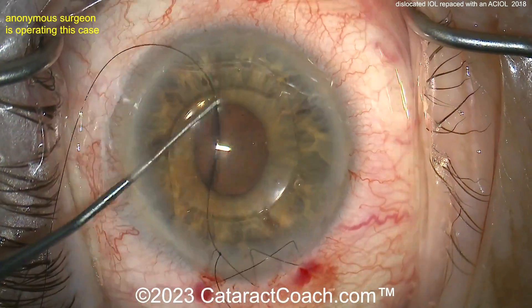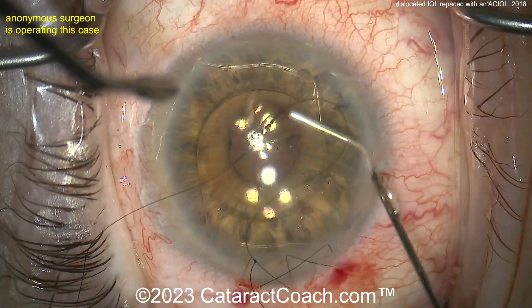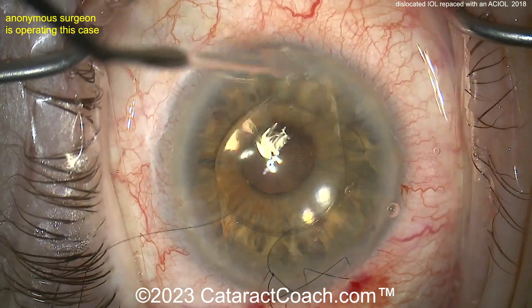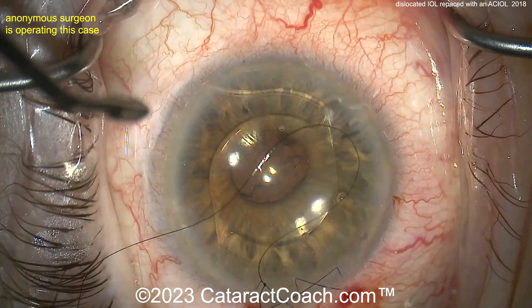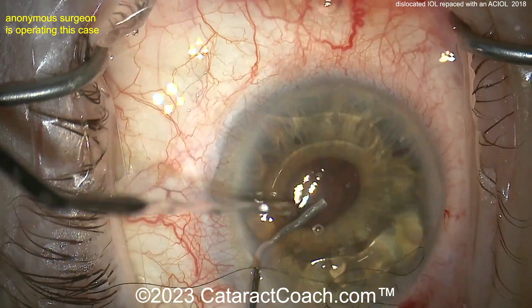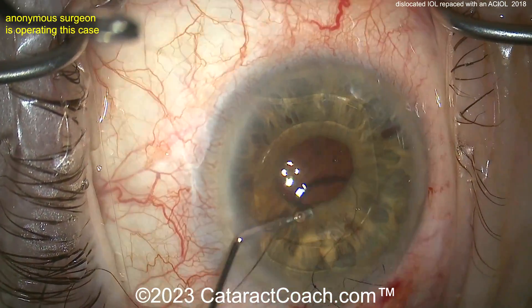I like the case here, though I would have done a few things differently. I would have done a pars plana incision at the beginning just to support the lens from behind and bring it up. I also would have done a scleral tunnel to access inside the eye and insert this large lens — it's a six millimeter optic, so you're probably doing a 6.5 millimeter incision, which is pretty big. I also would have placed some triamcinolone just to check if an anterior vitrectomy is needed — you're already there, you may as well.